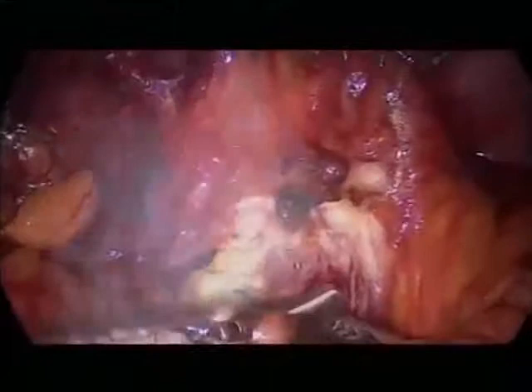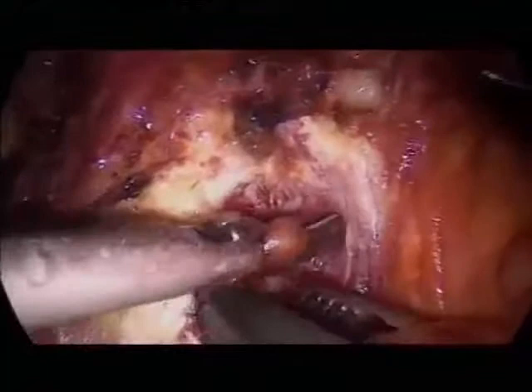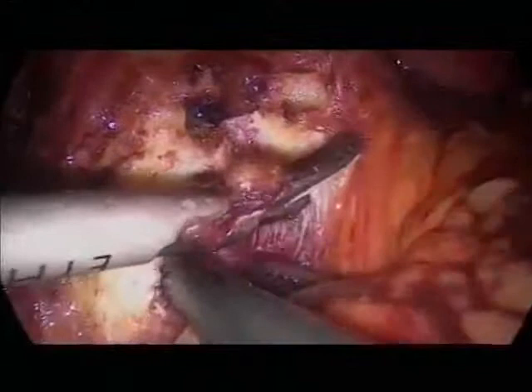Yeah, this is the bladder neck. You can see it very nicely here. I don't like the ace here. Are you trying to do a bladder neck sparing approach? Whenever we can, we try to preserve the bladder neck because it's very good for early continence.